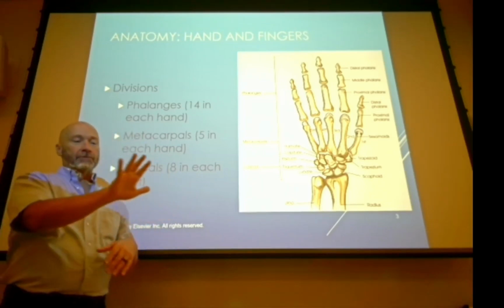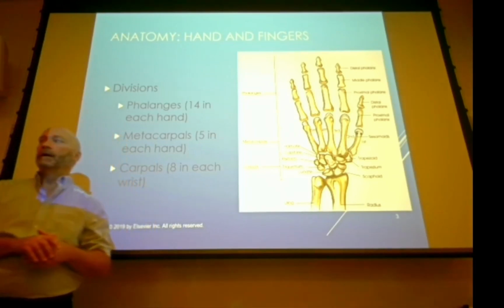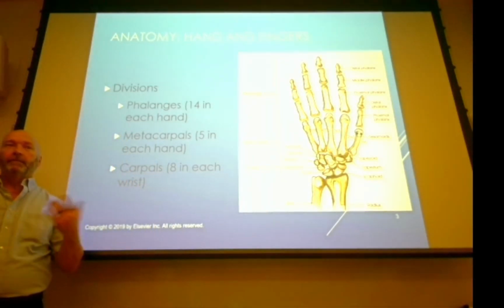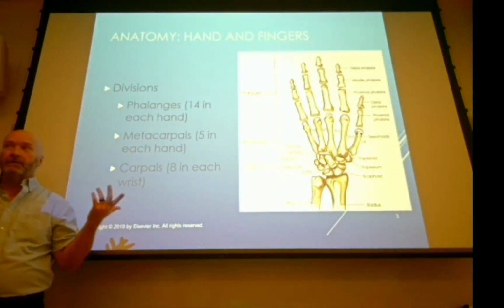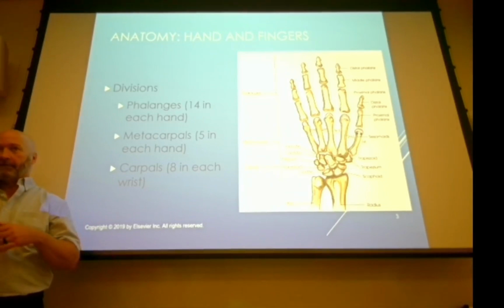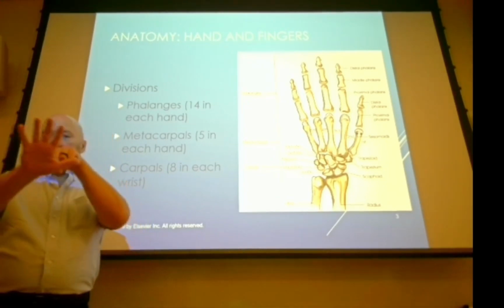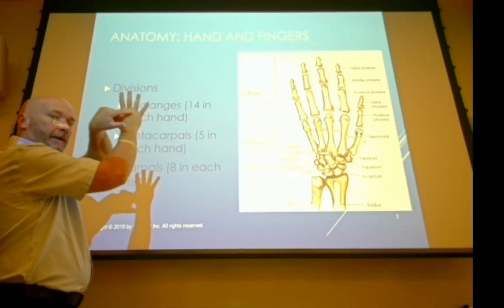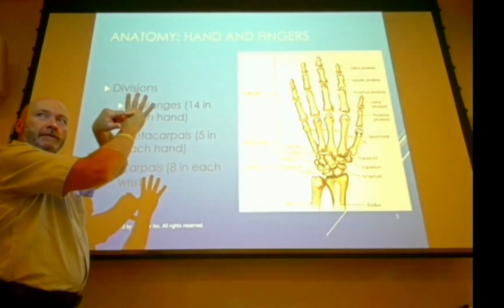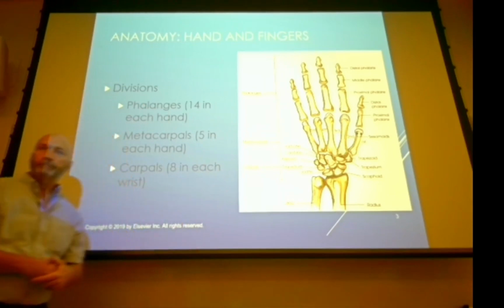And where are you going to put your central ray? In a word, in the middle, right? So that's all you got to know is in the middle. And then you got to look at the anatomy and say, what is the middle of all that? All right. So looking at your hand, what's the middle of that? The base of the 3rd digit, that knuckle right there, right? So now you just got to identify that knuckle, right? And that's what we're going to do right now.